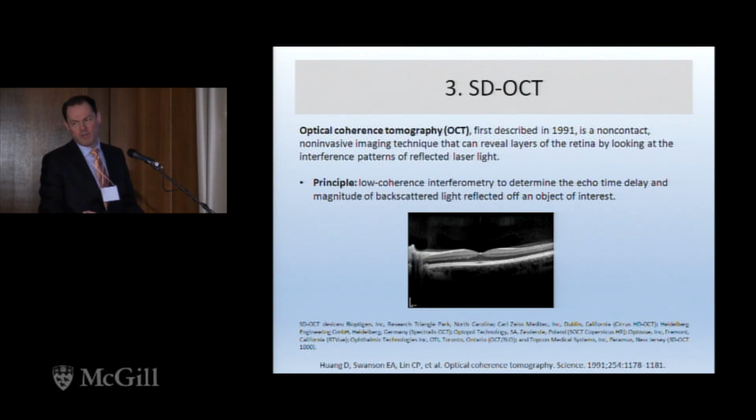So what about spectral domain OCT? This is a pretty ubiquitous machine. This is found in every ophthalmology clinic as well as every optometrist's clinic. And OCT has been with us now for almost 25 years.